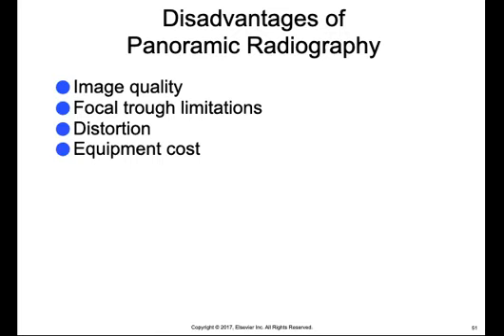Distortion is another consideration, because certain amounts of magnification, distortion, and overlapping are present on a panoramic image, even when proper technique is used. Also, equipment costs. The cost of a panoramic X-ray unit is relatively high compared with the cost of an intraoral X-ray unit.